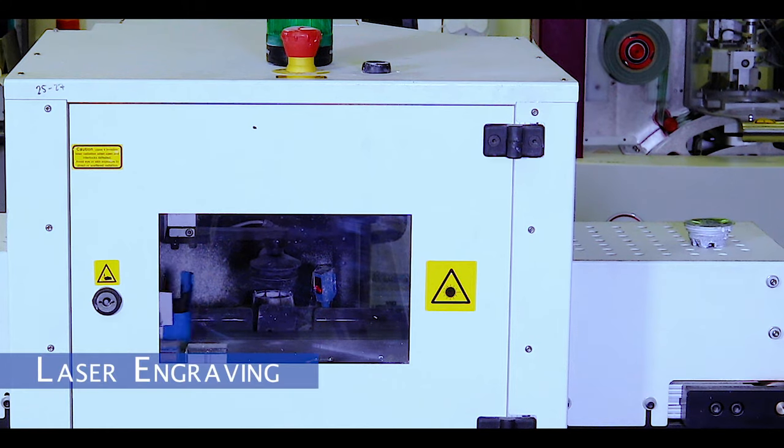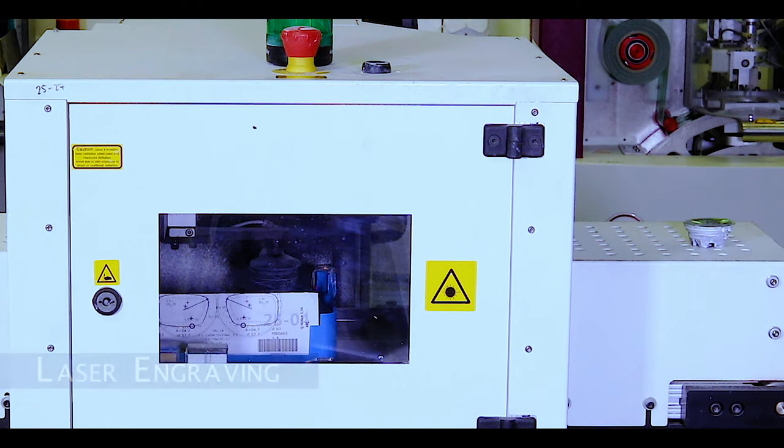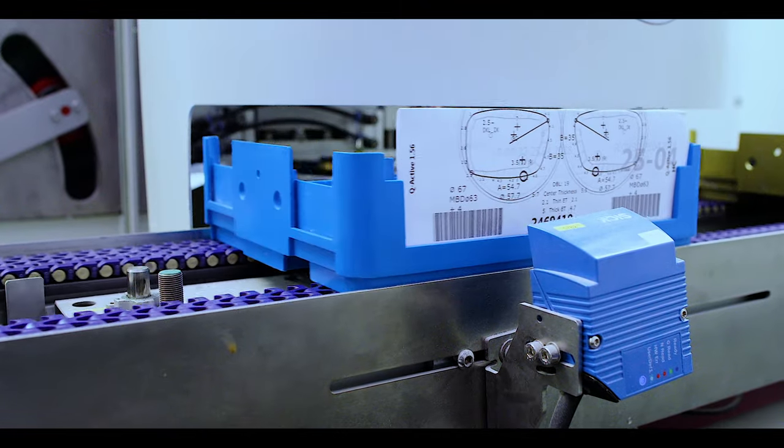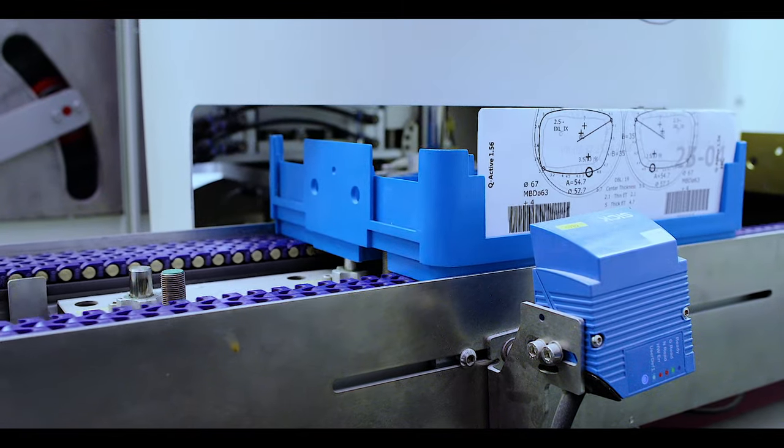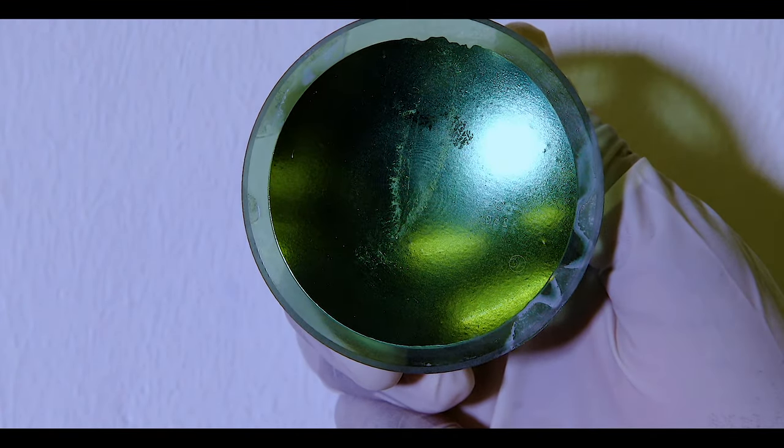The lens then proceeds to a precision engraving machine to lightly engrave various identification points on the lens away from your field of vision.